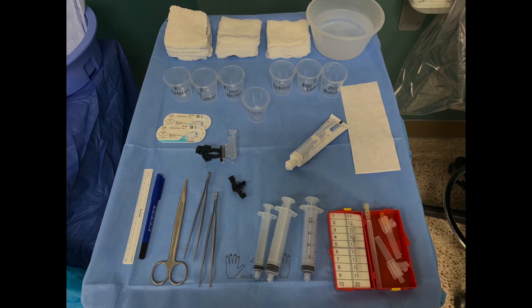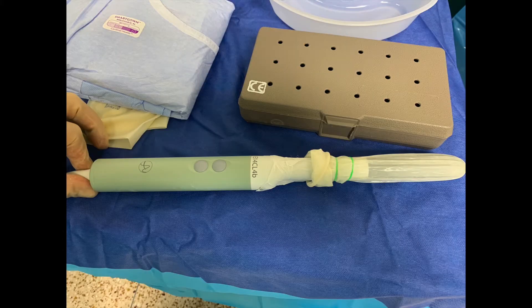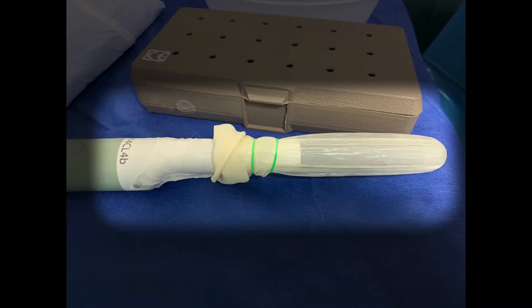In this picture, you can see the instruments used. The sample cups are labeled in the order of biopsy site. Note that lubrication is generously inserted in the condom prior to placement over the rectal ultrasound probe.